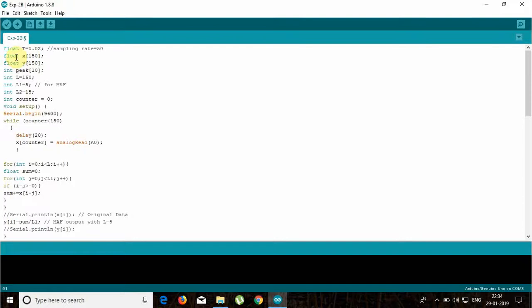Then we create an array X of size 150 for storing the original data. This array Y is for storing the values of the output of the moving average filter. This array peak is for storing the sample numbers of the peak values. This variable L is the size of the original data, the number of samples collected, and this variable L1 is the order of the first moving average filter. This variable L2 is the order of the second moving average filter.